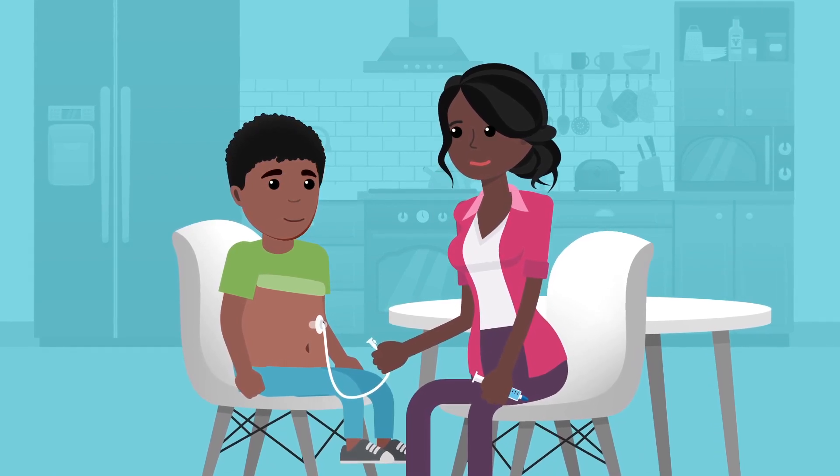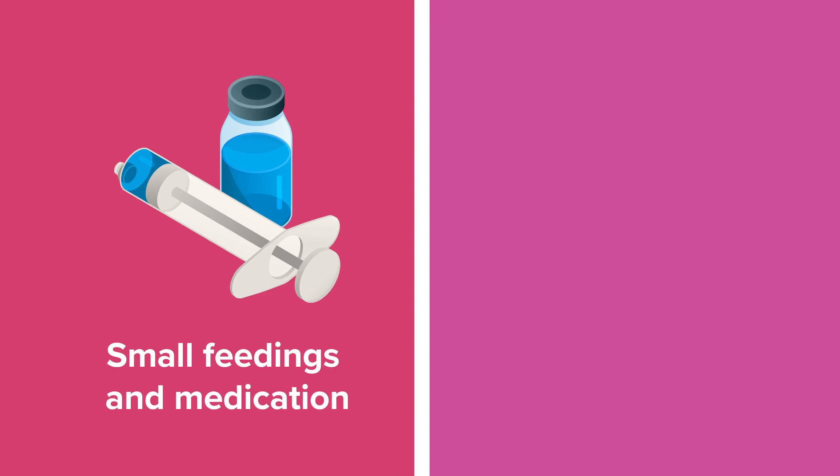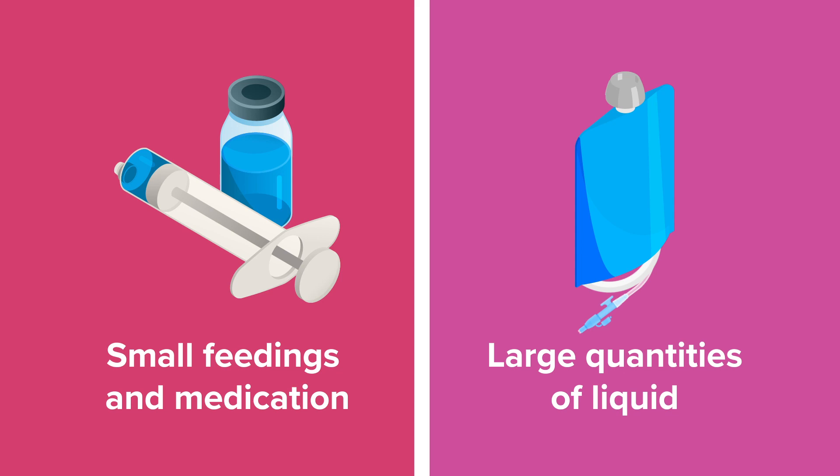Place fluids in the syringe or feeding bag and connect it to the G-tube. A syringe can be used to give small feedings and medication, while a feeding bag with a pump is used to deliver large quantities of liquid.